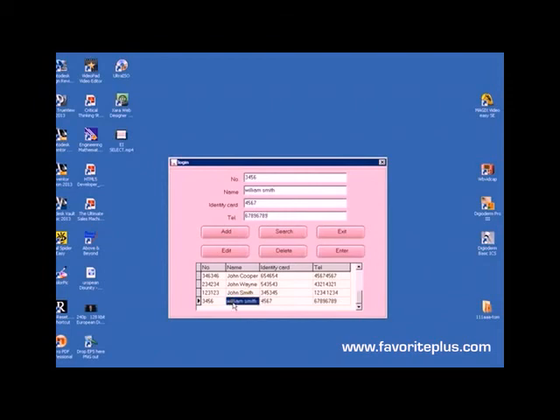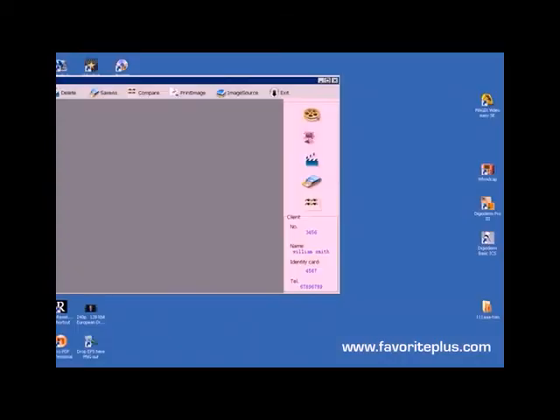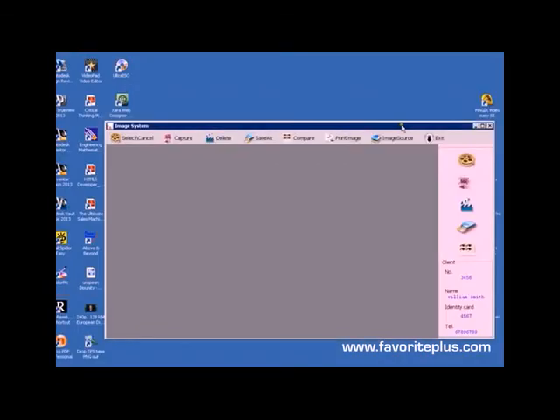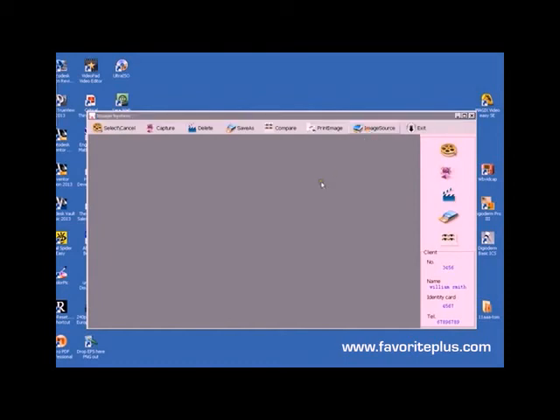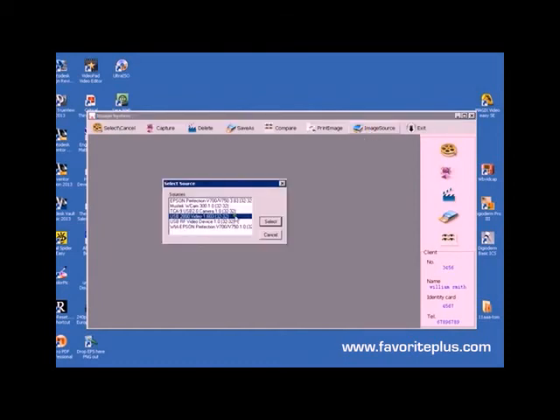To actually access the records of that particular patient, just double-click on his name and you'll see that it comes up with this screen here. So the first thing you want to do is actually go and select the actual camera. If you click on image source here, you'll see it'll come up with a little menu of all the different kinds of imaging devices you've got on your computer.